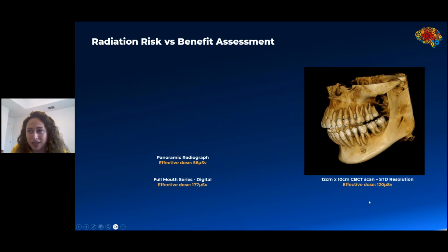But we also have to think back: by the time I think about taking a CBCT scan, it means I need it either for my diagnosis or for my treatment planning. Will a pan give me the same information, or am I gaining more from this CBCT scan? And other times we take a pan, we take multiple PAs with different angulation. You might even have one with an error, one with a cone cut, or one taken on the opposite side.